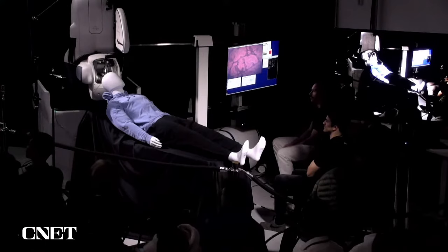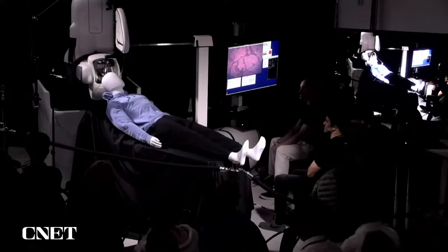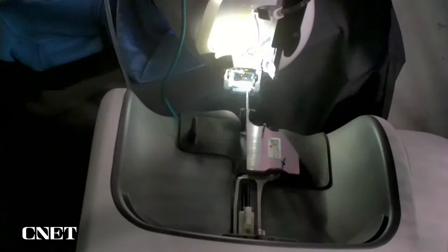This is our R1 robot with our patient Alpha, who is lying comfortably on the patient bed. This is what we call the targeting view. What you're seeing is a picture of our brain proxy — the pink represents the cortical surface that we want to insert our electrodes into, and the black represents the vasculature that we want to avoid.